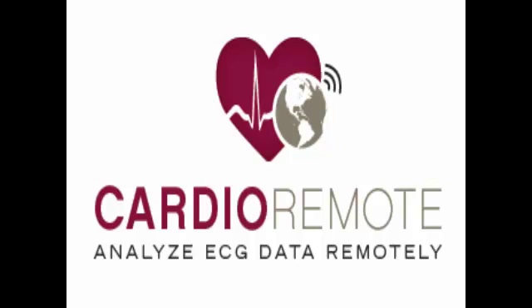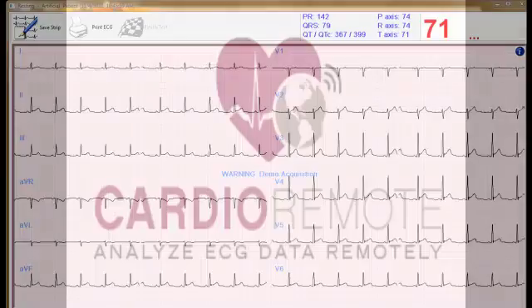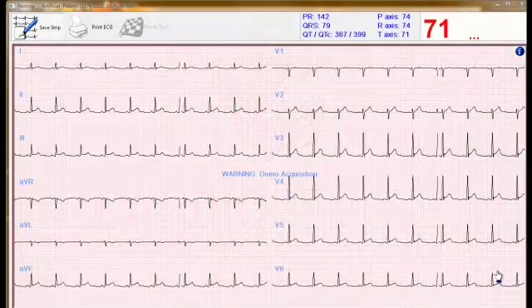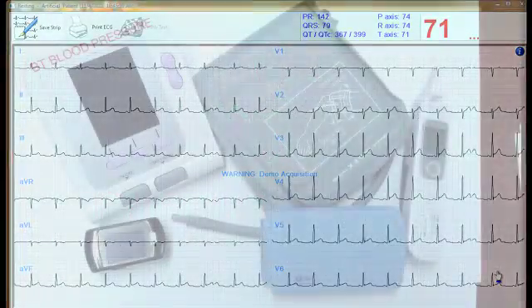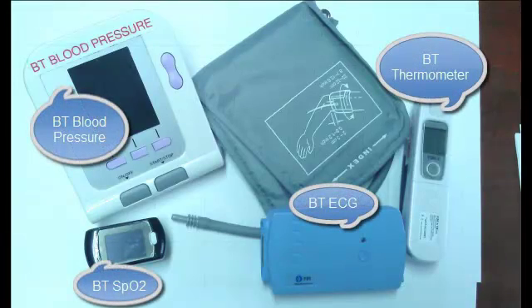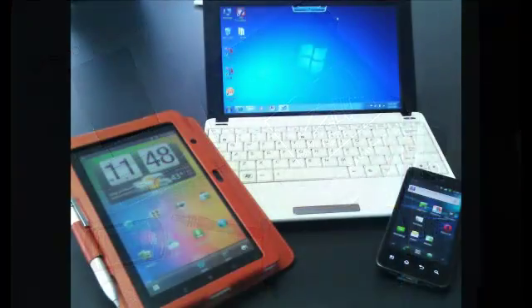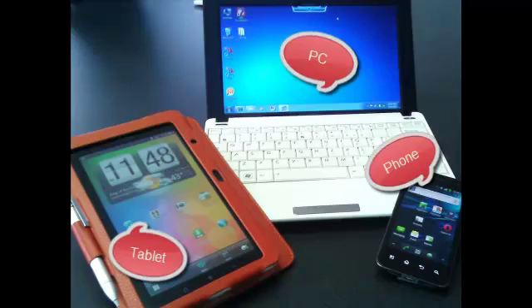Cardio Remote software allows users to collect patient ECG and other vitals, such as blood pressure, temperature, SPO2 or pulse oximetry, height and weight, wirelessly using our Bluetooth medical devices and any mobile device such as a phone, tablet, or personal computer.